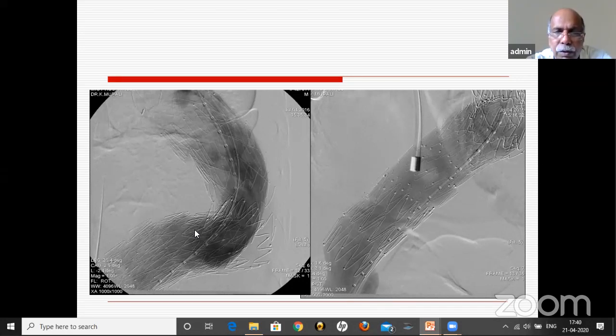There's another question. Sir, how much overlap should be made when deploying double stent grafts? There should be an overlap of 3 stents, minimum, especially in thoracic, I feel. Sometimes, to cut down the cost, whenever we have deployed with only 2 stent overlap, we have faced problems. 2 stent overlap in any device is almost 4 centimeter overlap. Even that doesn't seem to be good enough. I think the safest thing is to use at least 3 stents. If 3 stents is not possible, at least keep it up to 2.5 or 2 stents. Don't go below that. 3 stents I feel is mandatory.